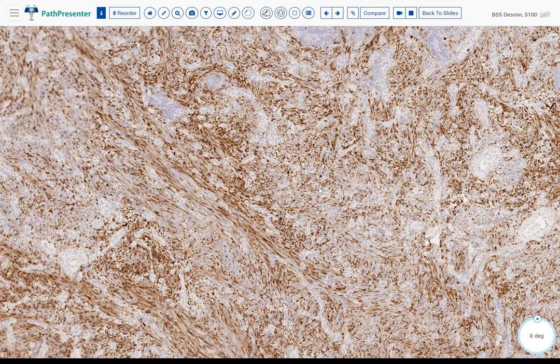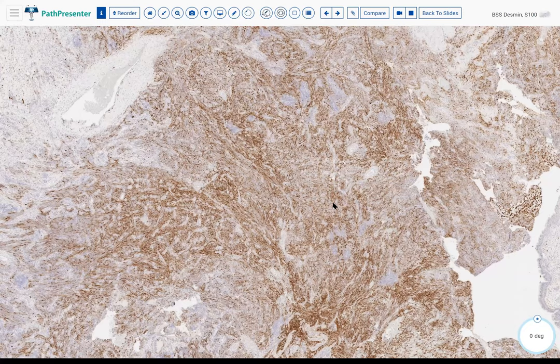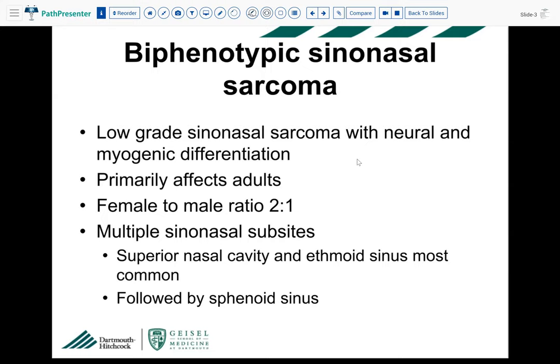So we have a sinus tumor that is positive for S100 and desmin, negative for keratin, and was actually negative for SOX10 as well — a very sensitive marker, although not entirely specific for neural crest origin. The case I'm showing is actually a relatively new and quite rare entity called biphenotypic sinonasal sarcoma, described only in 2012. In the old days, this was most commonly called a low-grade malignant peripheral nerve sheath tumor because of S100 positivity.